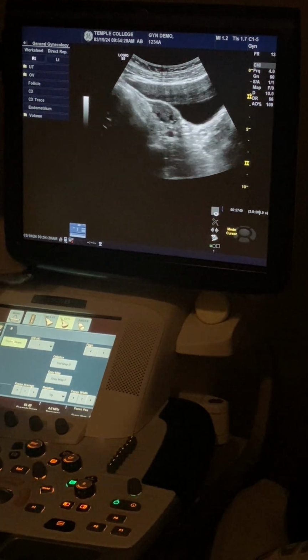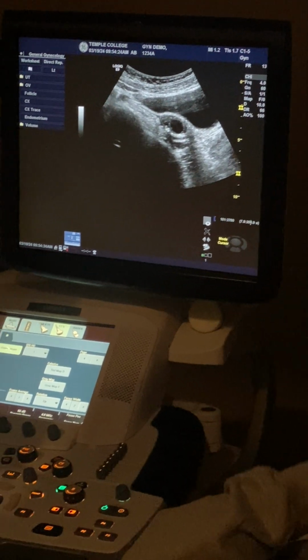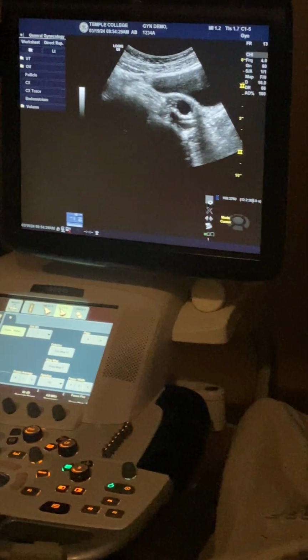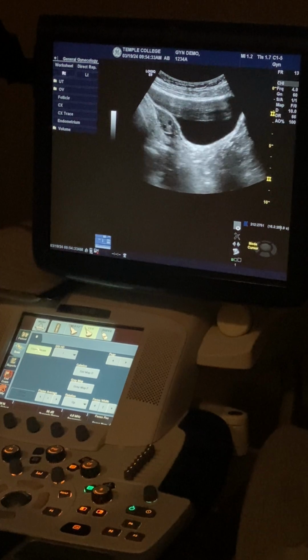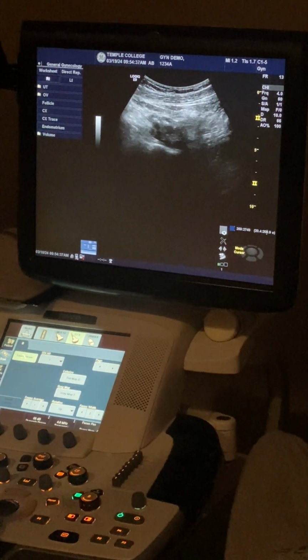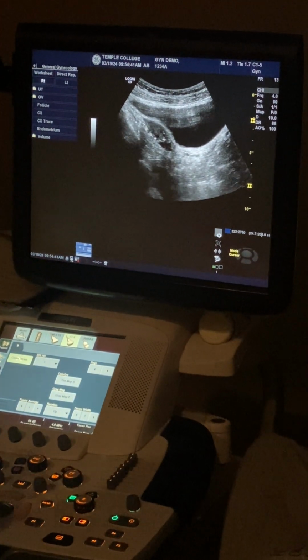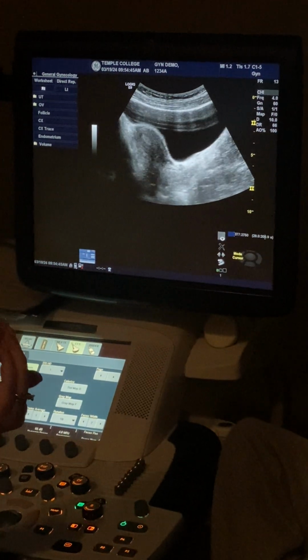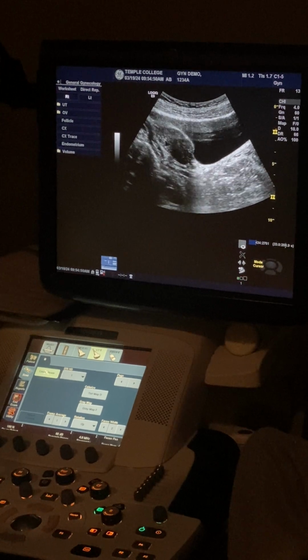And when you're doing your ovary images, it says long and trans, measure length in AP, color, and pulse wave. So you are doing a Doppler on the ovaries. But the protocol seems like it only asks for one picture, one long, one trans. I would appreciate it if you gave me a little bit more than just one image. Just show me that you evaluated it. I can give just this one picture and be there's the ovary, done.